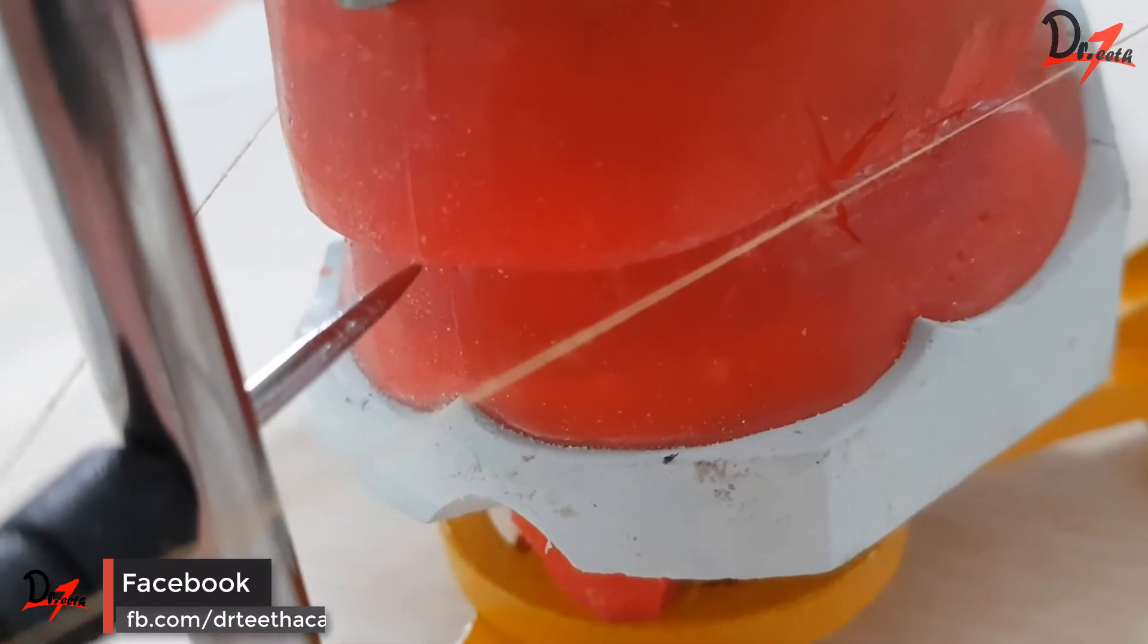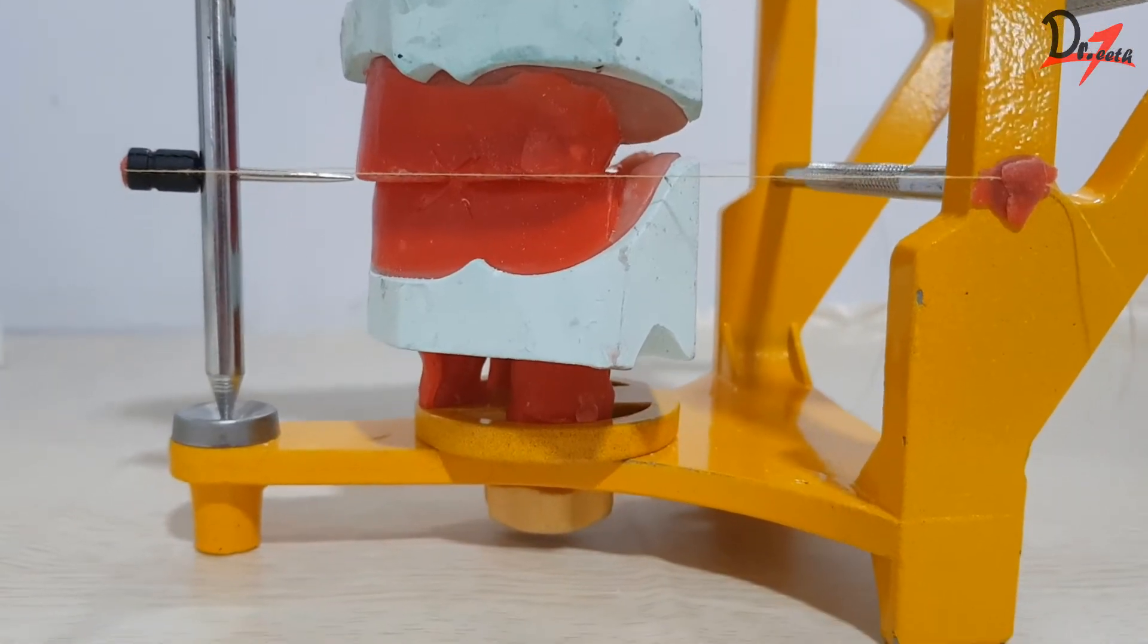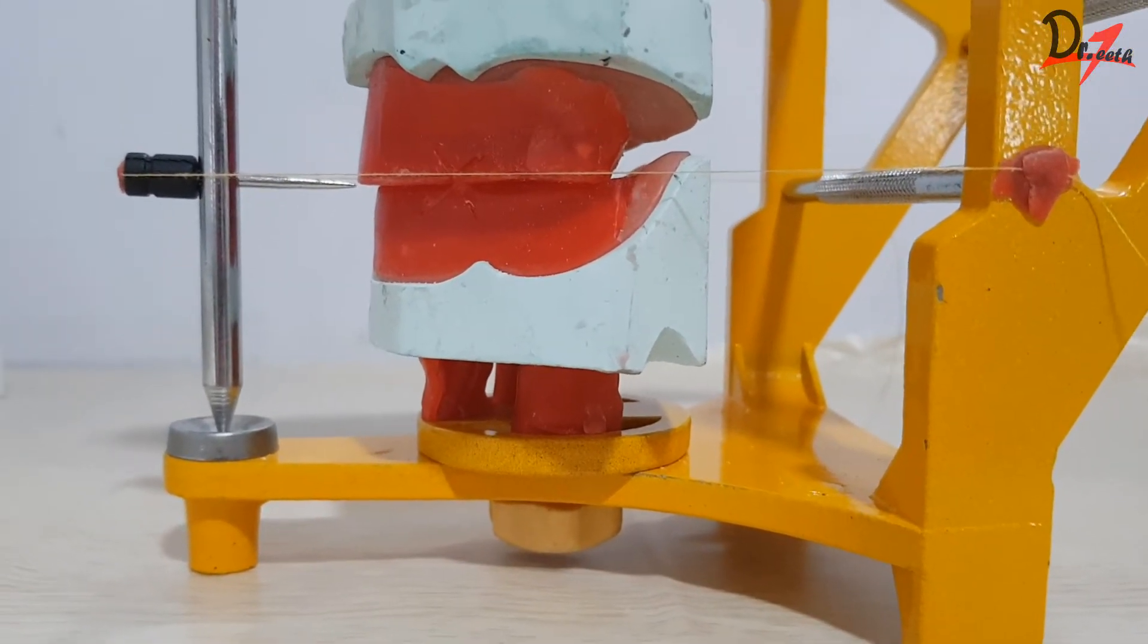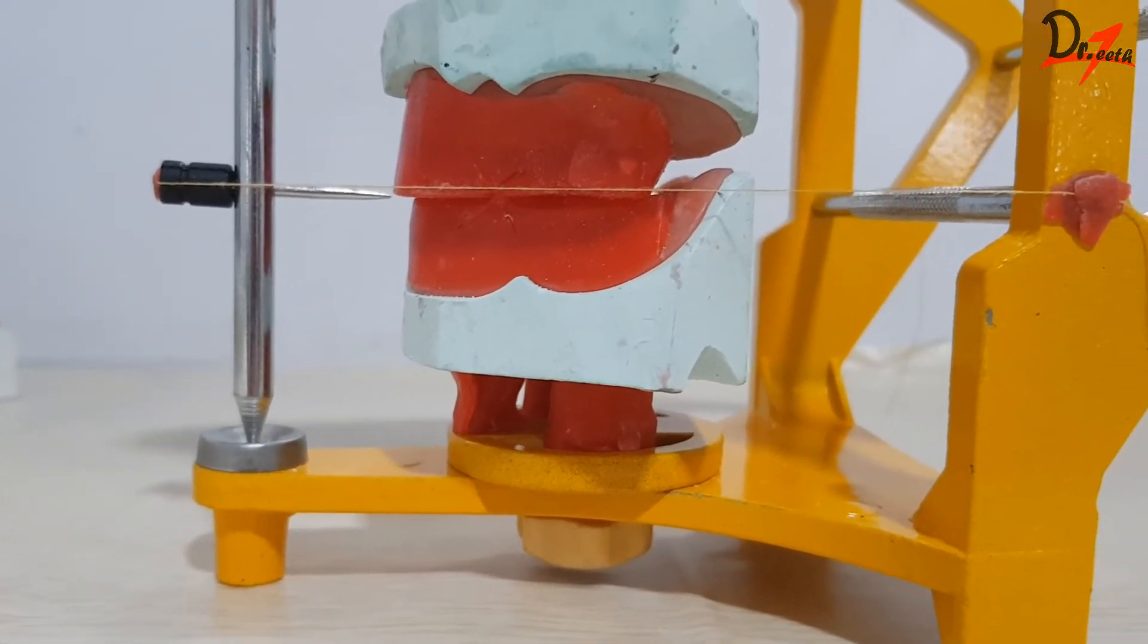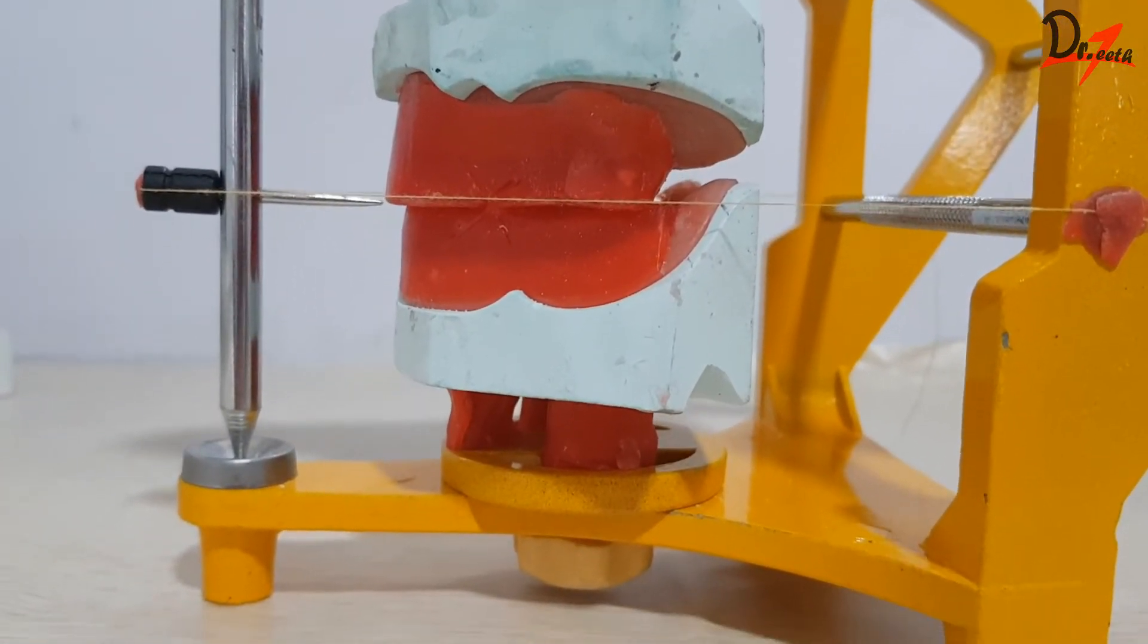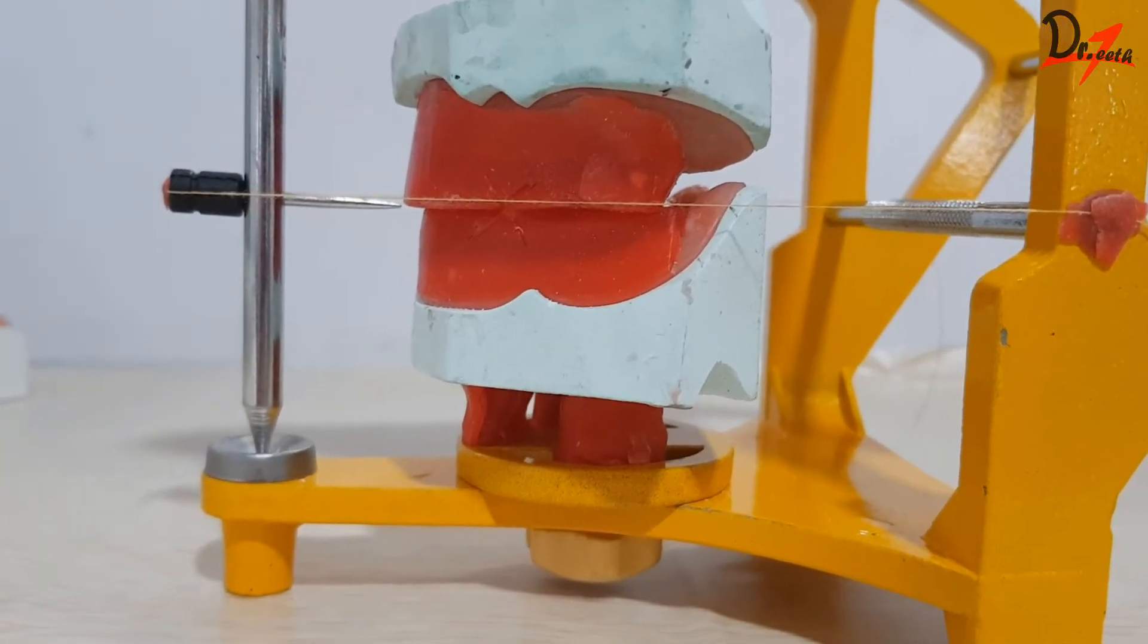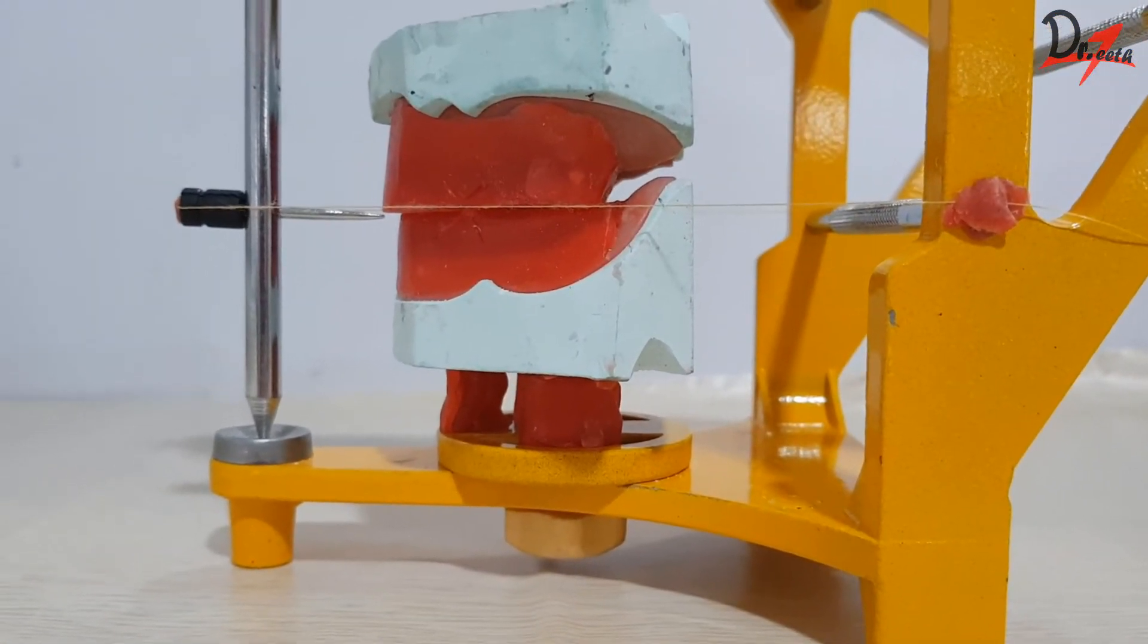Then checking from the left side, what you have to do, you have to keep your eye at the level of the thread and see if the plane of the rim is in line with the thread. And we have to adjust the modeling clay or the modeling wax accordingly.